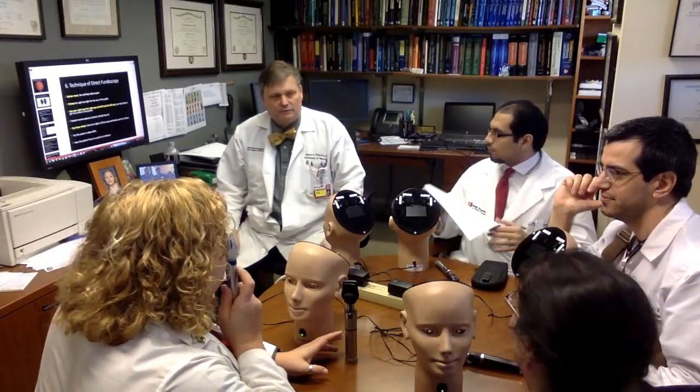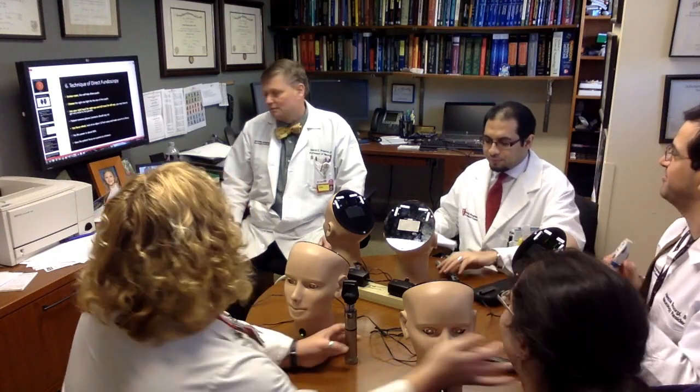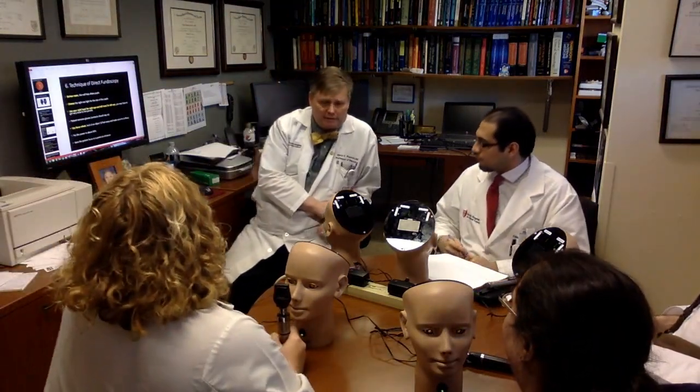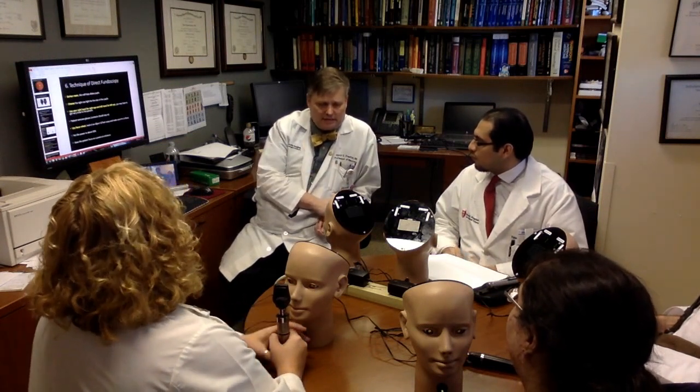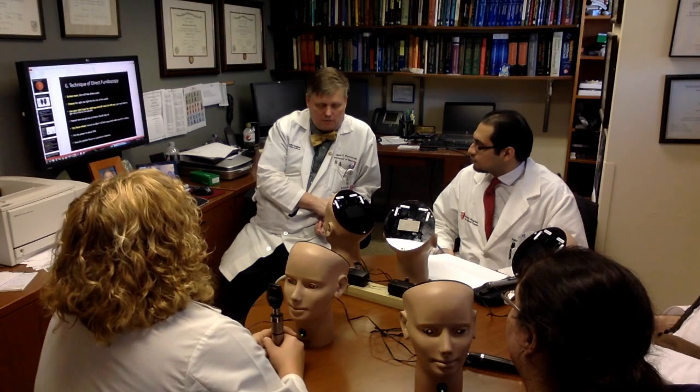All right, everyone have their ophthalmoscope? Yes. Good, welcome to our simulation testing here. So what we're going to do is go over some normal and abnormal fundi with our models today.